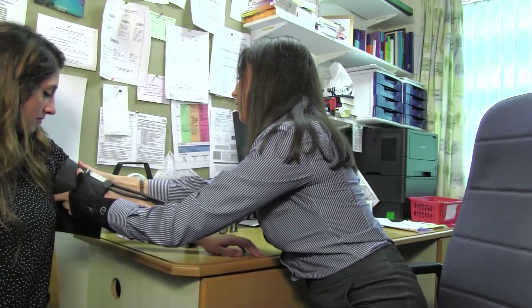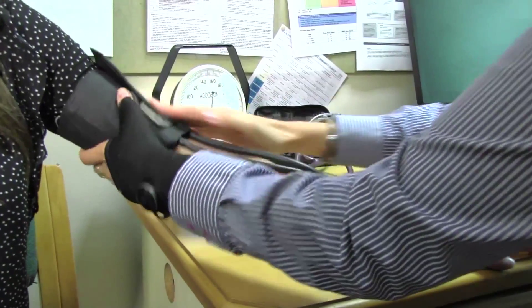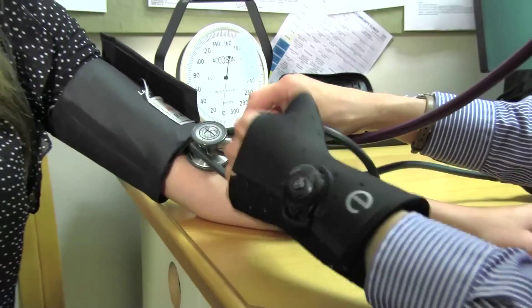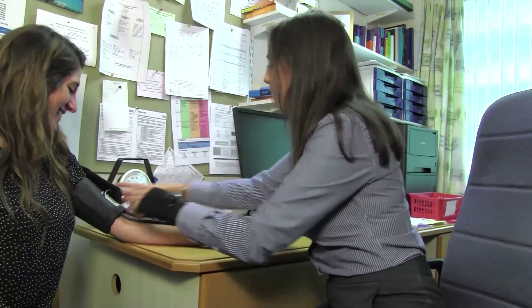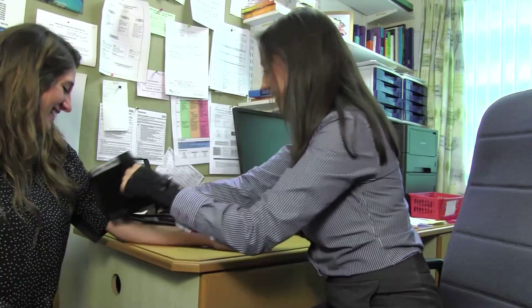It's made things much easier in terms of showering and washing. I went on holiday and it was great because I could swim and keep the brace on, then take it off to dry it and put it back on again. With my work as a GP it's been really helpful too, because in terms of practical procedures that I do, it gives me more flexibility than a large plaster cast would, which has been great.